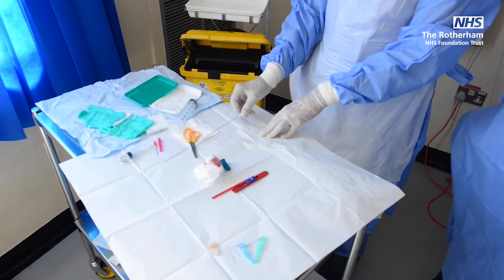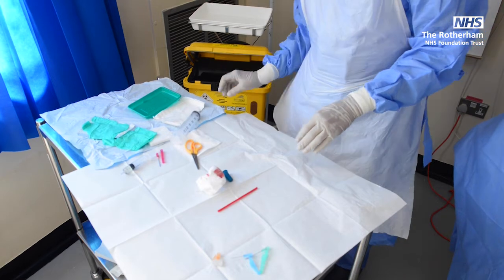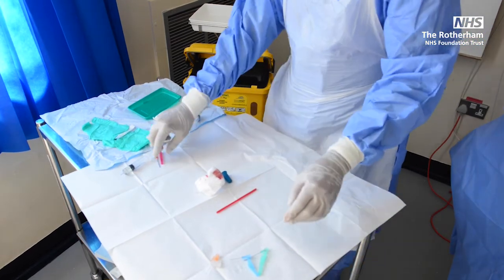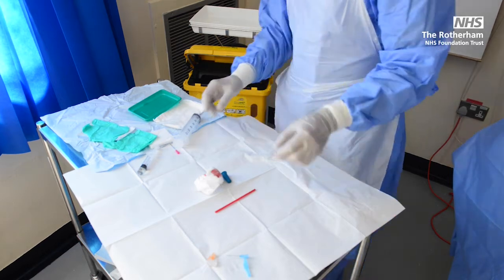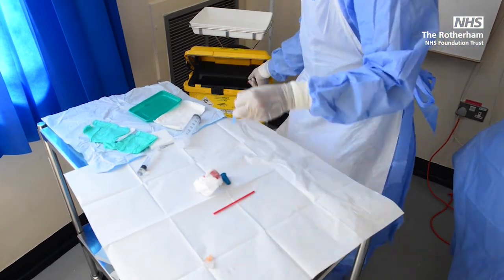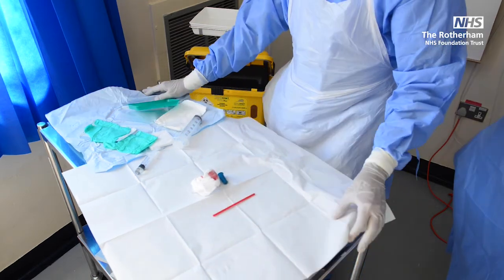Make sure once you've done the procedure, dispose of all the sharps, so your needle, your scalpel blades, your scissors, and all your green needles, and the blunt needle as well. And dispose of all the other bits into the clinical waste.